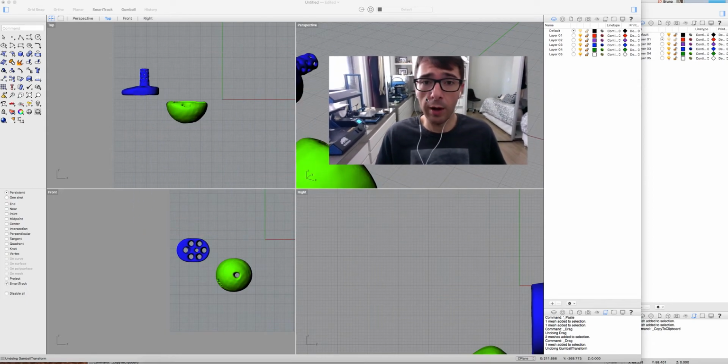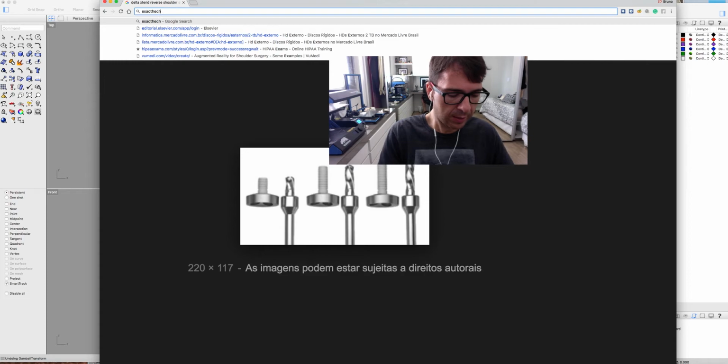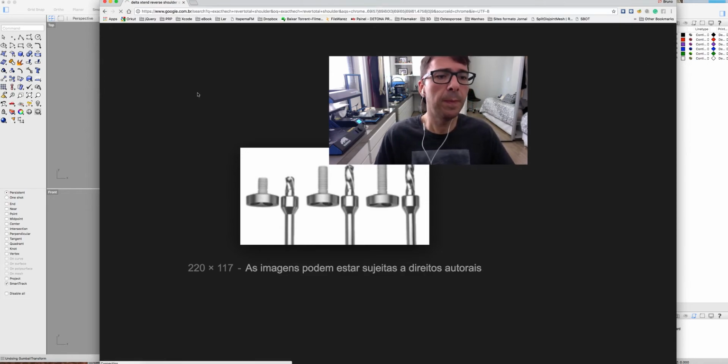We are going to draw and design a reverse total shoulder arthroplasty, the glenoid part. We are using a CT scan that we have downloaded from our patient, a patient that had a reverse total shoulder arthroplasty. This implant is the Exactech implant. I'm going to open here, Exactech reverse total shoulder.